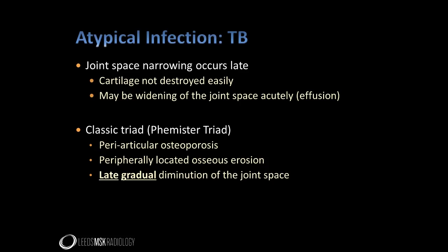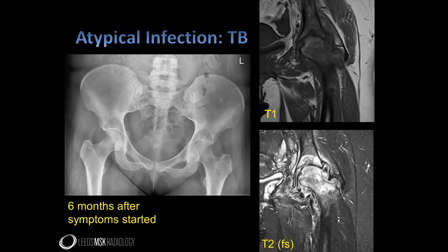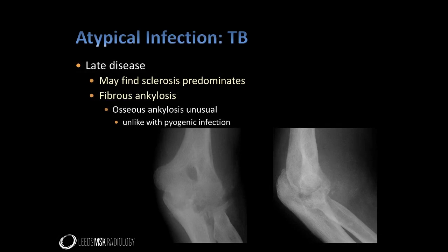The classic description of the radiographic appearances of TB arthritis describes three features known as the Phemister triad, which emphasises the late and gradual loss of joint space seen in TB in contrast to the rapid joint destruction seen with pyogenic arthritis. This patient had had left hip pain for about six months before seeking medical attention. There is periarticular osteopenia, but in contrast to the pyogenic cases, the joint space is still relatively well preserved. MRI shows the bone oedema, joint effusion and synovitis with periarticular oedema. Later in the disease, sclerosis may become a feature of TB arthritis as demonstrated in this elbow joint. In contrast to pyogenic joint infection, osseous ankylosis of the joint is relatively unusual; with TB, severe joint involvement more commonly leads to a fibrous union across the joint.